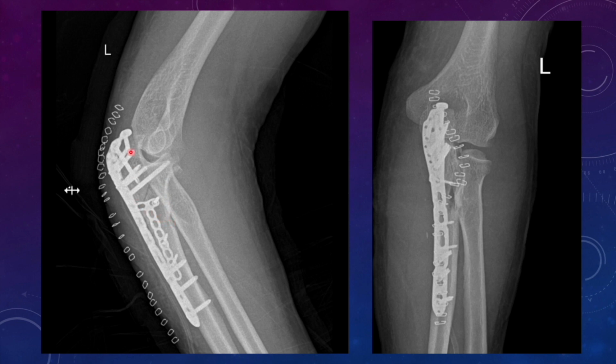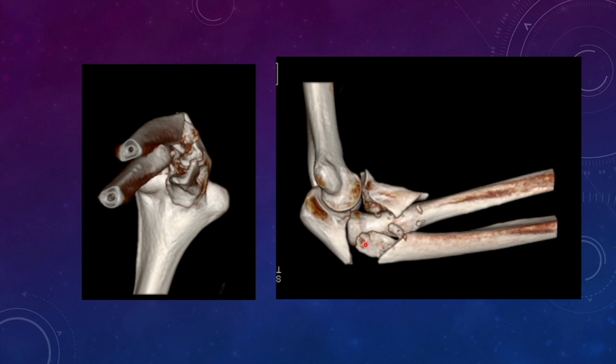And for olecranon, we had placed a routine olecranon plate, and we had secured a long screw which was going till the coronoid also. So a kind of good stability which has stabilized the medial column, that means the sublime tubercle and the anteromedial facet of the coronoid, and we have stabilized the lateral column also by repairing the insertion of the lateral collateral ligament complex which was inserting over that lateral fragment we had seen here.